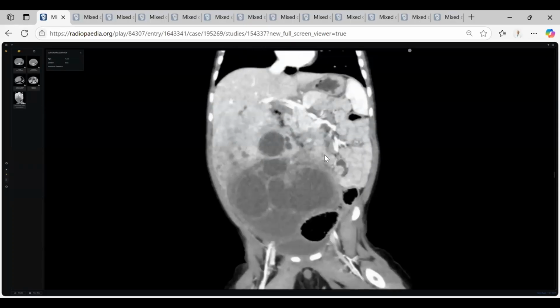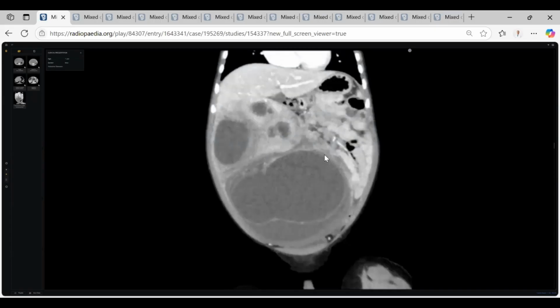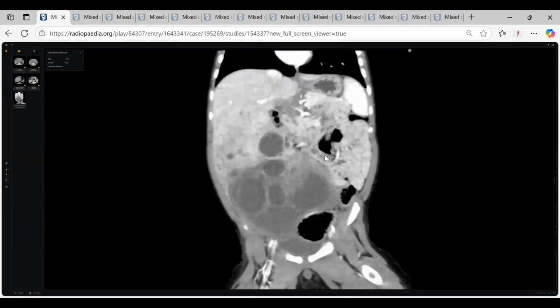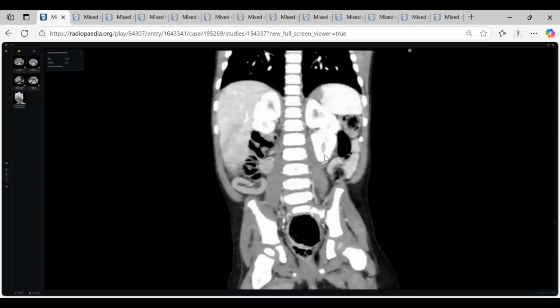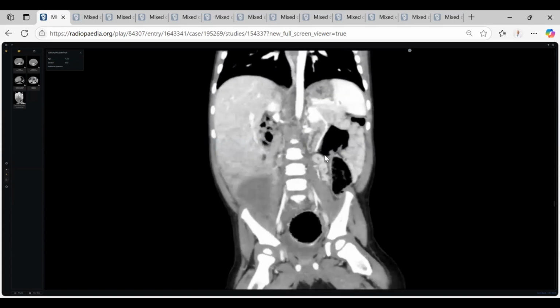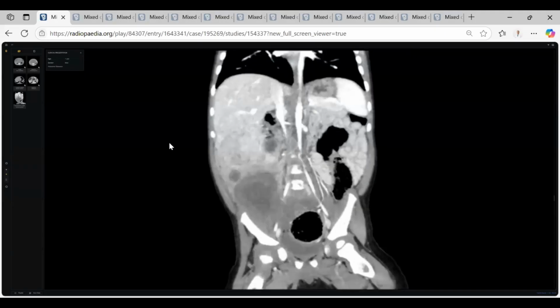And this is the clue of differentiation from hepatoblastoma. Second point, hemangioendothelioma, like hemangioma, gives the closing iris sign. Okay. Thank you, doctor, so much. Thank you that you picked up this is hepatic, not renal, not suprarenal. And this is very important. It was the clue to rule out renal and suprarenal. This is a congenital hepatic mesenchymal hamartoma. Thank you so much. Okay, thank you, doctor.